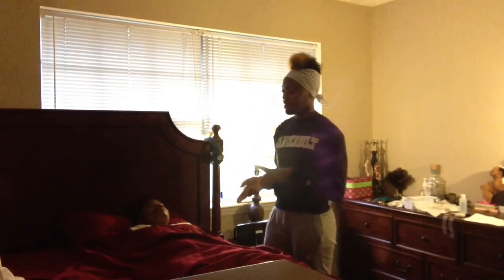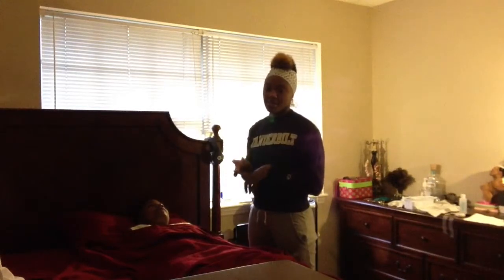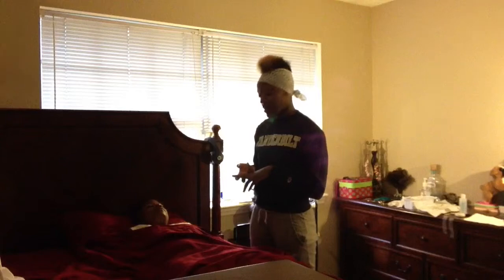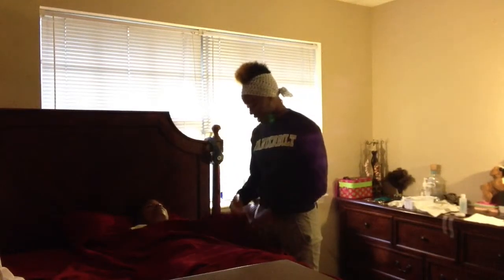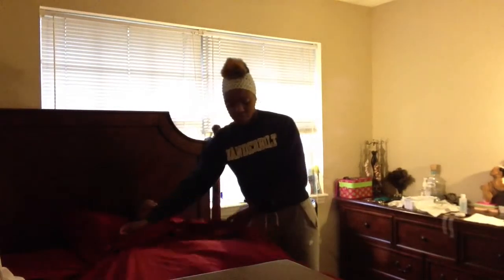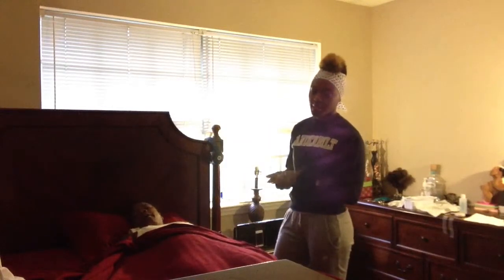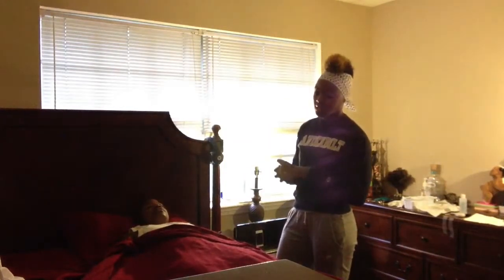I would check Ruby's name against the medical record. I would also check a second identifier. I would check for any allergies that Ruby may have. I would explain the procedure to Ruby while raising the bed to a comfortable working height. That way I can maintain good body mechanics.